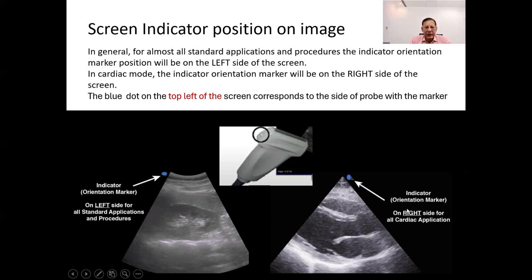This deviation from standard positioning in cardiac mode is based on the conventional viewing of the heart, as if the observer is looking at the patient's chest from their feet, as if the patient were lying down facing upward. By aligning the orientation marker on the right side of the screen in cardiac mode, it matches the conventional viewing perspective of the heart.